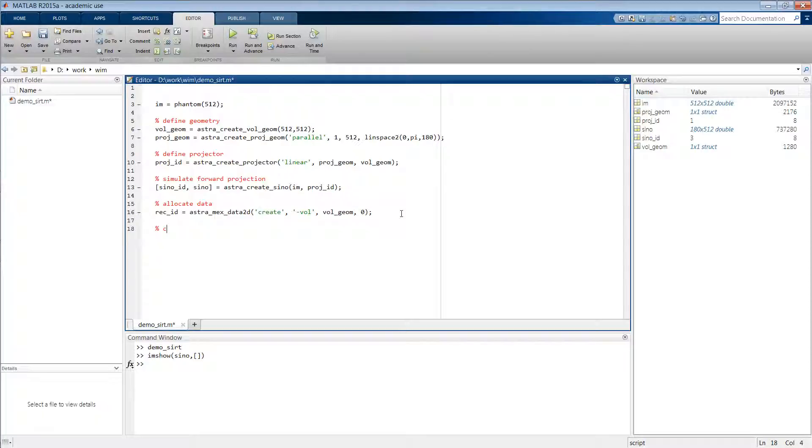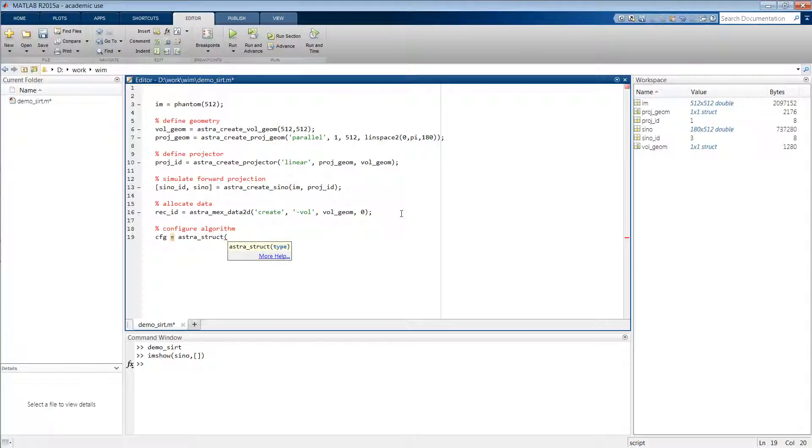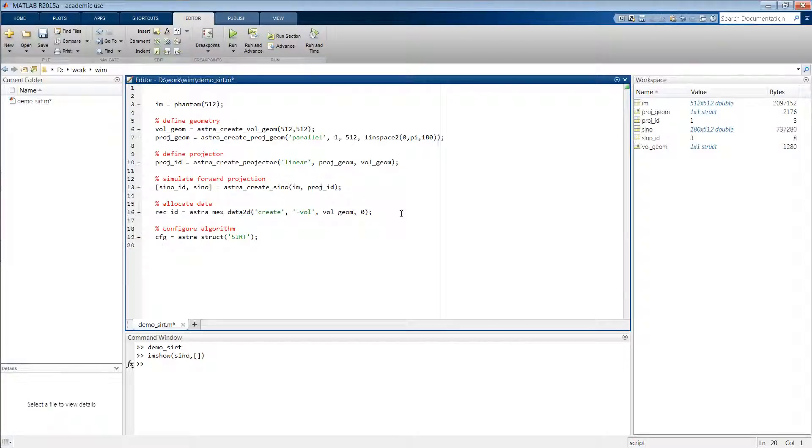Then the next step is to configure the SIRT algorithm. We'll do this by creating a configuration struct. We'll type astra_struct and then as an argument we have to specify the name of the algorithm that we want to configure, so in our case it is SIRT. Then there are a few parameters that have to be set in this configuration struct.